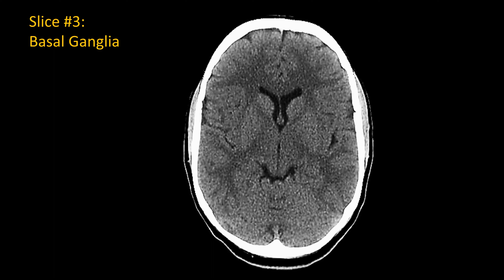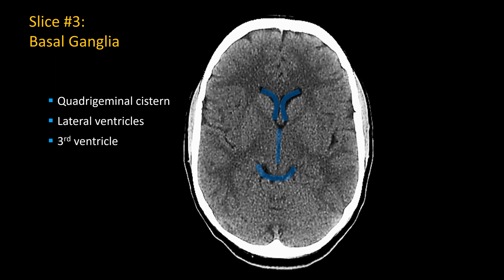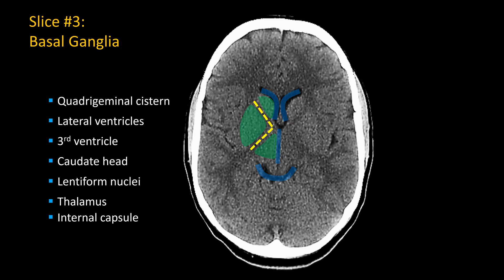One level above at the basal ganglia, you should again be able to see the smile-shaped quadrigeminal and ambient cisterns. The lateral ventricles are small and relatively symmetric. Through the front, you will see the third ventricle, which on axial view looks like a small straight line and should be right in the midline. Basal ganglia structures include the caudate head, lenticular nuclei — medially the globus pallidus, laterally the putamen — and the thalamus, all separated by the internal capsule.